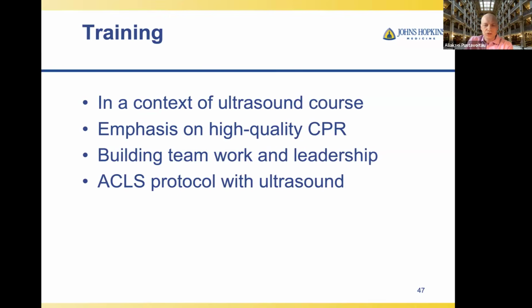So training, we usually train it in the context of an ultrasound course, because some of the people are novices. They don't necessarily know how to use ultrasound. So we teach both: the protocol to use and how we incorporate it into the CPR. There is an emphasis on high quality CPR. We work really hard on building teamwork and leadership. It's very similar to the training one receives during ACLS training. So you can think of it as ACLS protocol plus ultrasound.